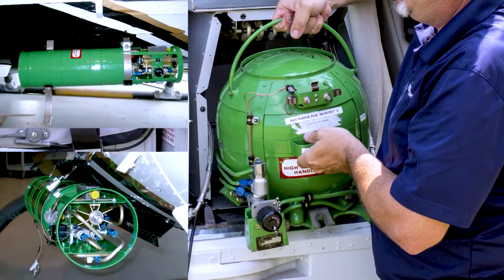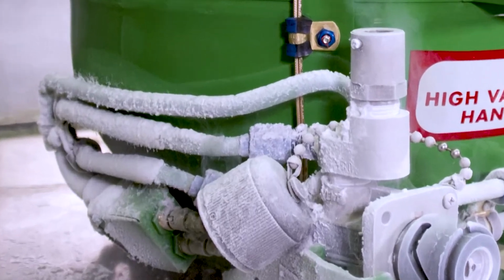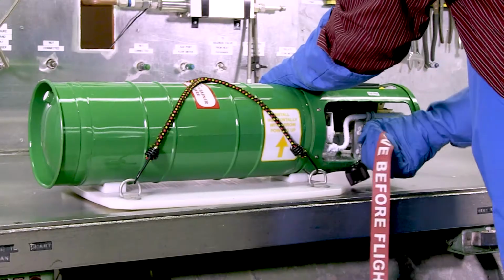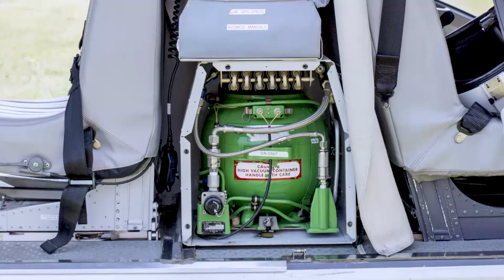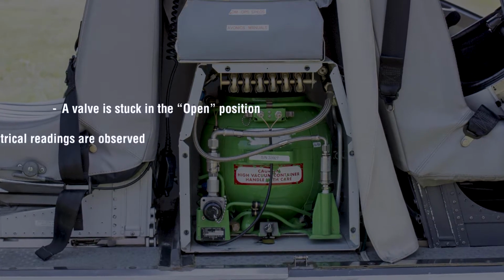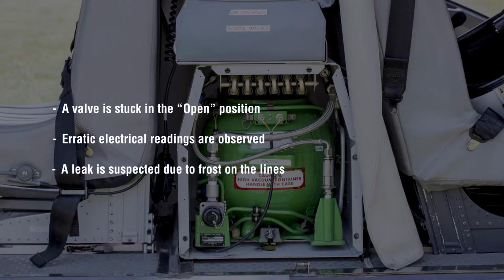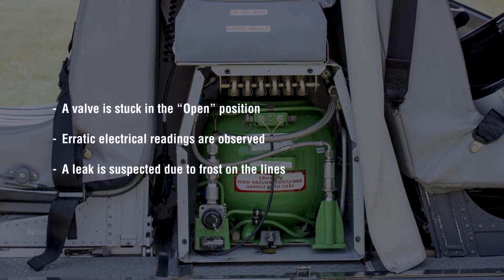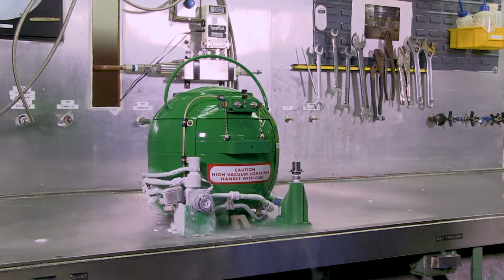Liquid oxygen converters are often returned to Essex for repair with conditions that occur during normal operations. Some conditions are common issues that may be corrected in the field. These include: a valve is stuck in the open position, erratic electrical readings are observed, a leak is suspected due to frost on the lines. Before returning a converter for any of these conditions, you should first troubleshoot the issue using the following procedures.